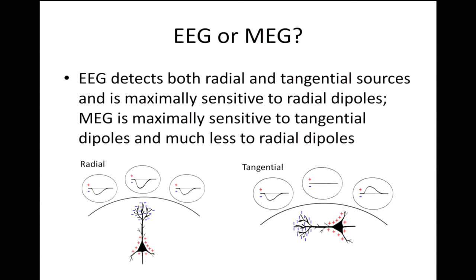And quite a bit of research has been done, or is been undergoing, on how to do noise cancelling in the software. That means developing more advanced algorithms, especially to model your environment. That's what you need to do, because MEG is not portable. Once it's there, it's there. So you have to have a very good model of your environmental disturbance. And once you have a good model of how your environmental disturbance behaves, then you can use it in the software for offline noise calculations or offline noise elimination.